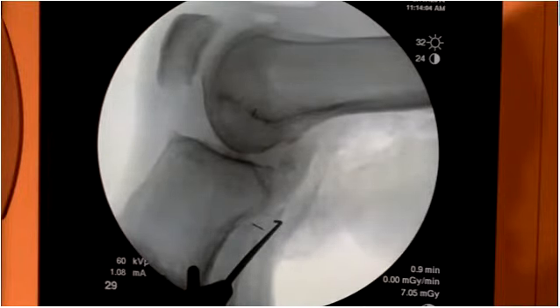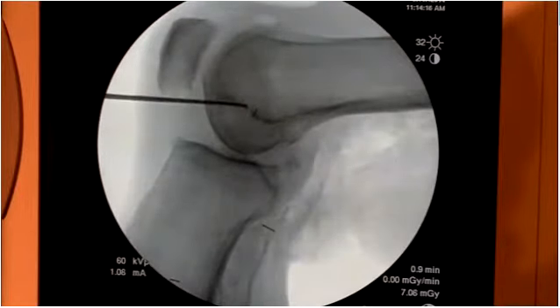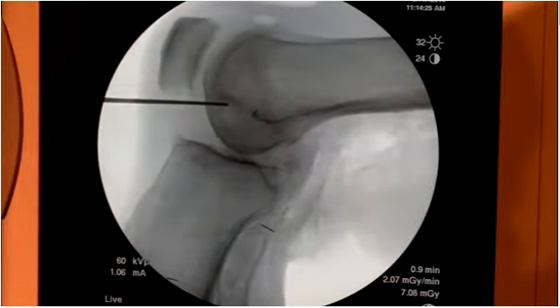On the femur, that I can show you. I think it's right there. X-ray? Sorry. I have to find the condyle. Here's the condyle. It's probably here. Right there. Yep. You agree? Yeah, I think it's important that it's real close to the edge of the condyle there for the popliteus.